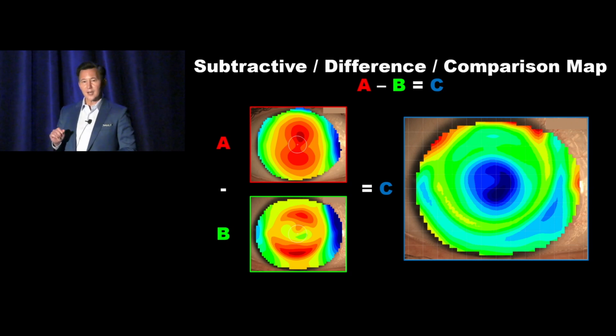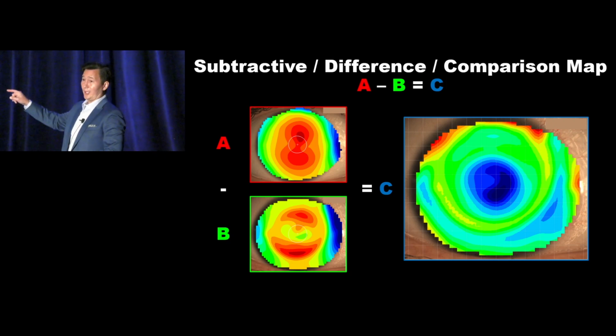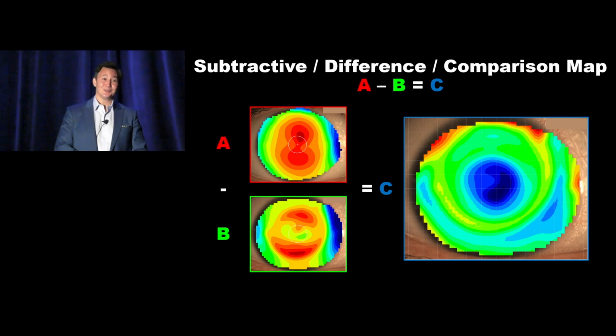If you take nothing away from my talk today, take this away, that you need to figure out how to use the subtractive map when you get home. Okay, maybe take two things. Number one, take good baseline maps. Number two, figure out how to use the subtractive map.